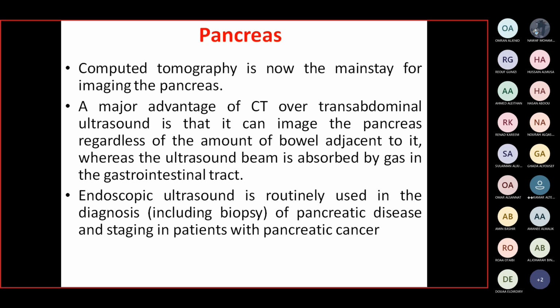So this pancreas may be covered by the bowel or the stomach. Usually there is difficulty in visualizing this pancreas by ultrasound. But CT can demonstrate the normal or abnormal pancreas more clearly than ultrasound.